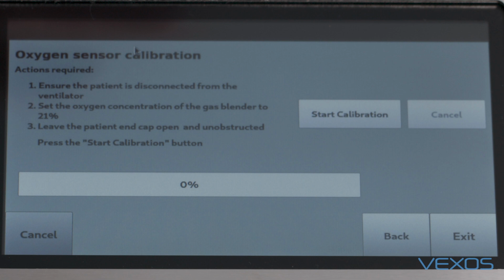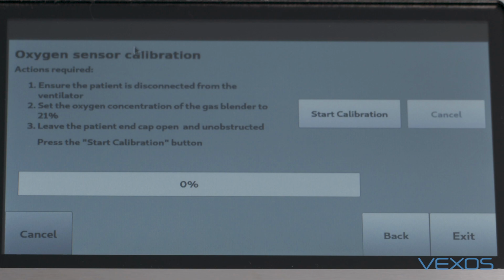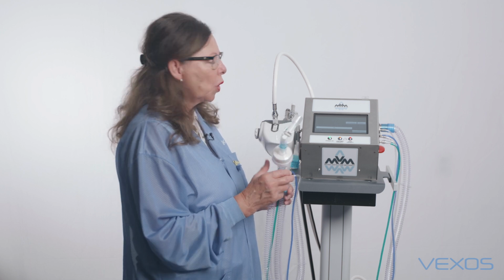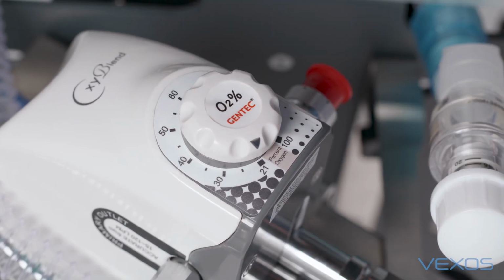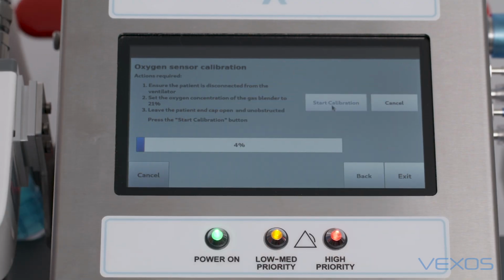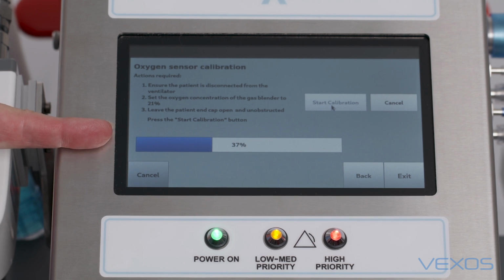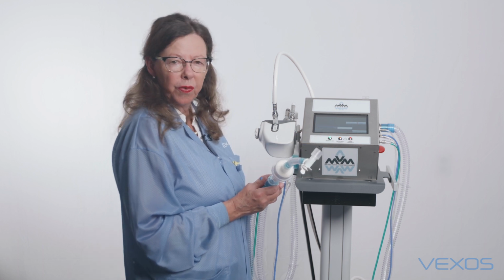Starting with the O2 calibration. Pushing on that tab brings us to this screen. All the instructions are written on the screen, simply to follow. So the patient is of course disconnected and the circuit is left open. The blender must be turned to 21% and start calibration begins. This bar indicates the amount of the test that has taken place, and when 100% of that test has been completed, it will indicate either a success or failure for this test.